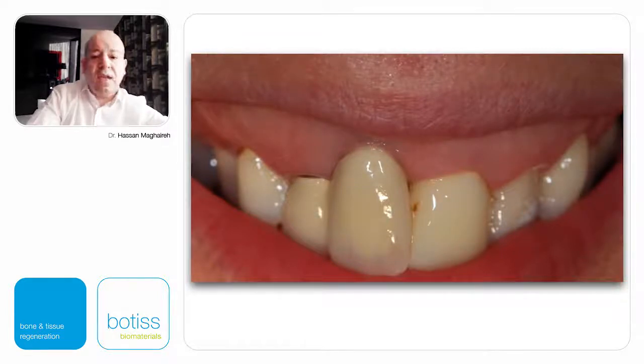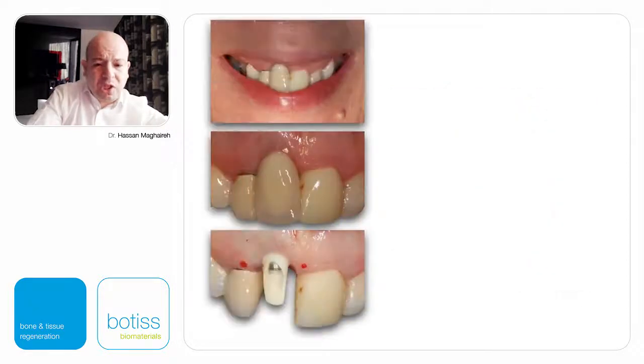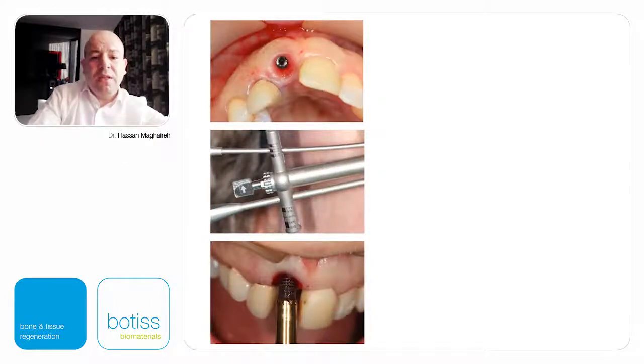This is another case. The dental implant was placed immediately, and it wasn't really giving good results. Obviously, you could tell that the positioning of the implant wasn't right. And the moment you remove the crown, you could start to appreciate that everything was done not according to the system we were taught to do. Implant was placed too deep, implant was placed too labial, implant was placed on the wrong angulation. And as you could see here, within a year of implant placement, that very thin labial plate remodeled, and we've got recession, and here we go. Things started to look not in the right way.